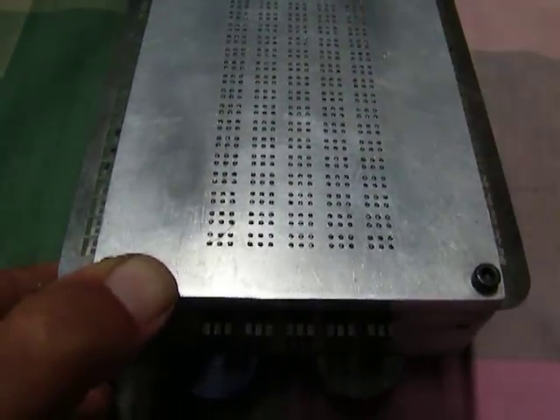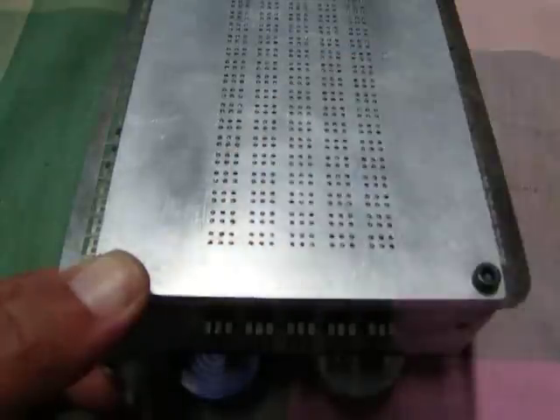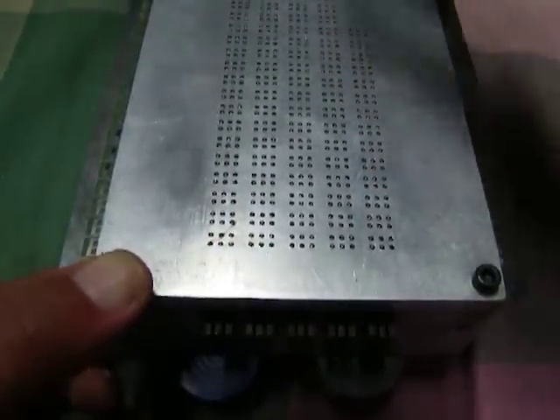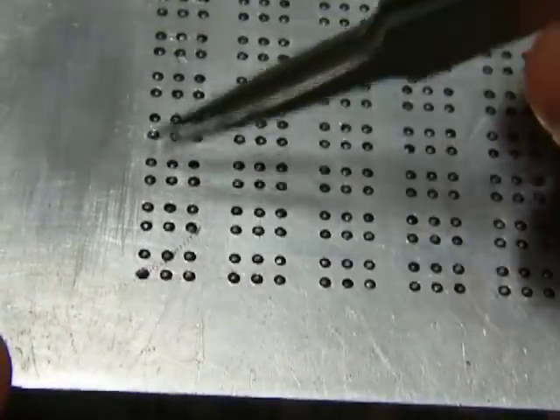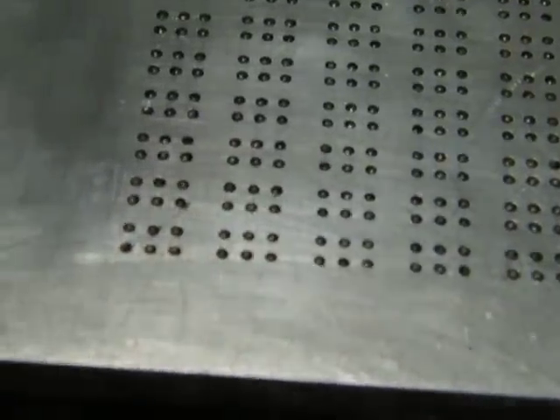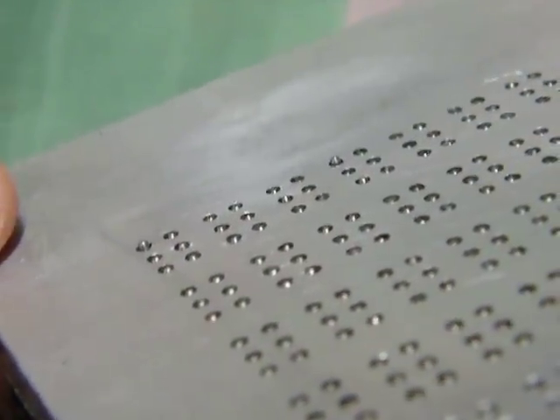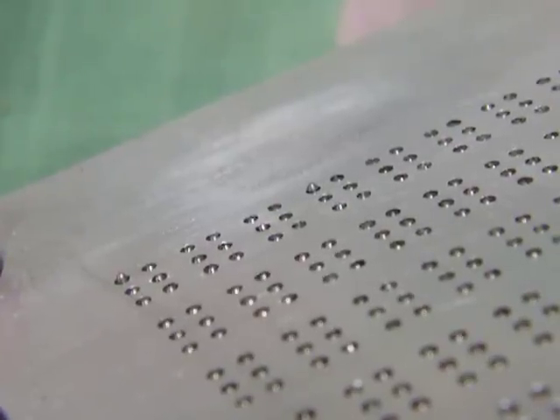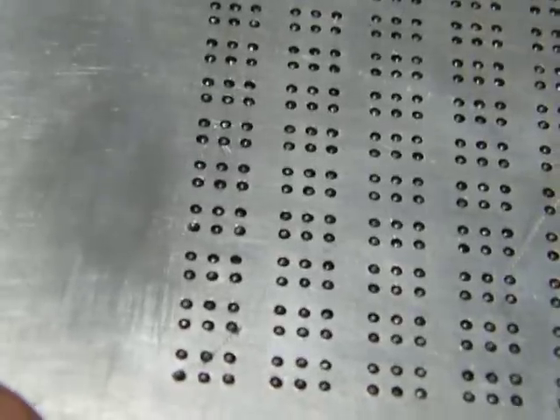I'll try and zoom in so that you can see. You've got A in pin 1 in cell 1 and cell 4 over there. The rest of the pins are dropped. Okay, you can see them, pin 1 and 4. I'll try and go at an angle so that you can see them. Okay, I think you can see them there, pin 1 and pin 4. That's how you're using row and column to actuate pin by pin, cell by cell.